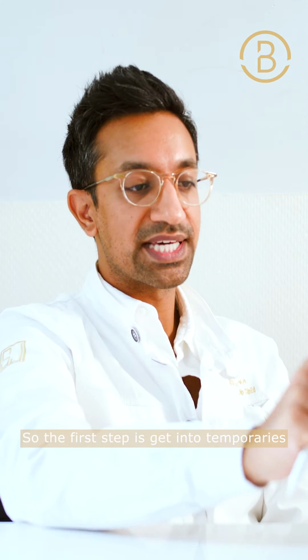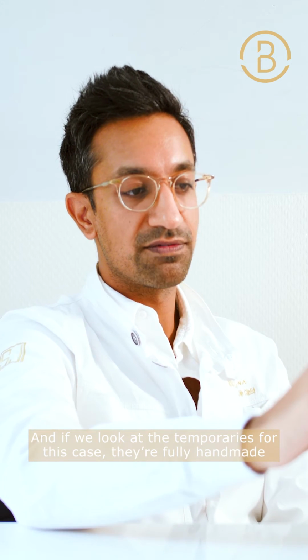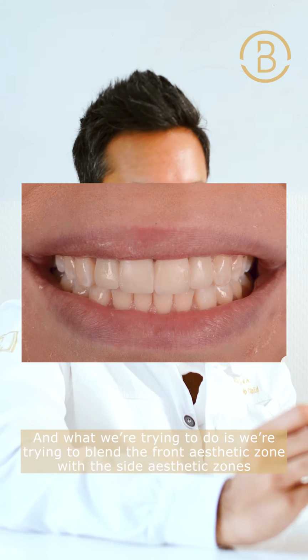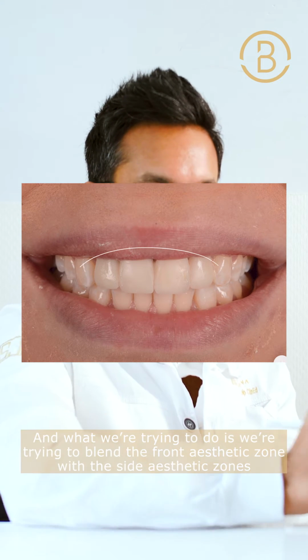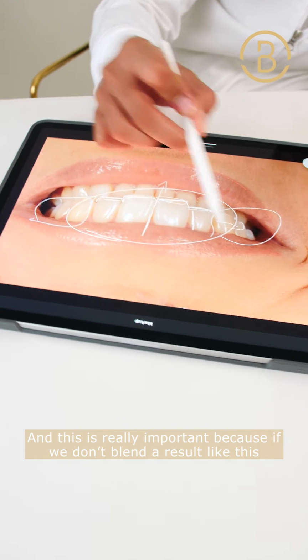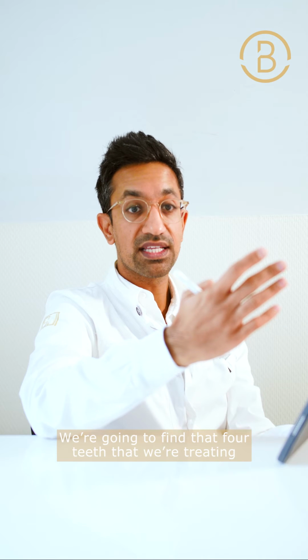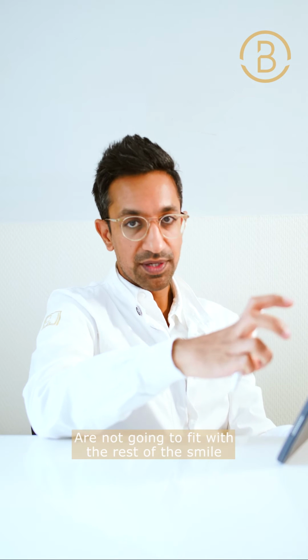So the first step is get into temporaries, and if we look at the temporaries for this case, they're fully handmade. And what we're trying to do is blend the front aesthetic zone with the side aesthetic zones. And this is really important, because if we don't blend a result like this, we're going to find that 4 teeth that we're treating are not going to fit with the rest of the smile.